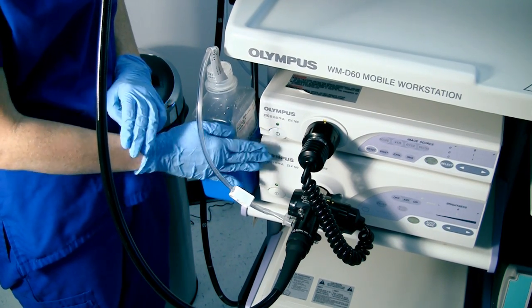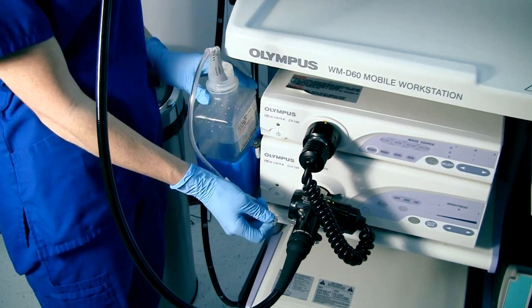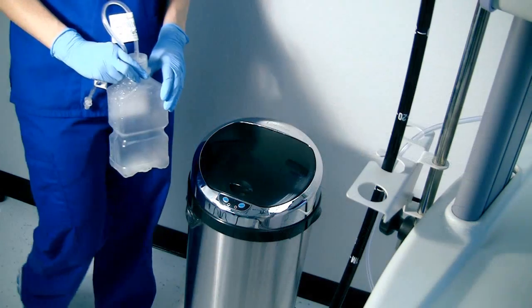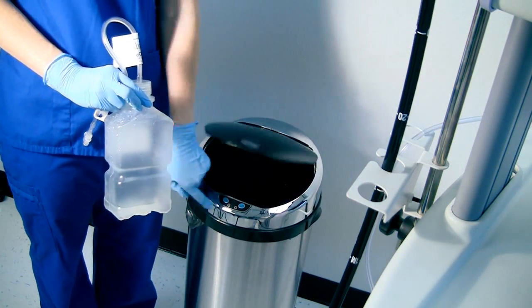Disposing of the Smart Cap is one of the easiest features of the technology. Follow the normal removal directions. However, when you are finished for the day or 24 hours has arrived, take the Smart Cap and the water bottle it is attached to and discard it appropriately.